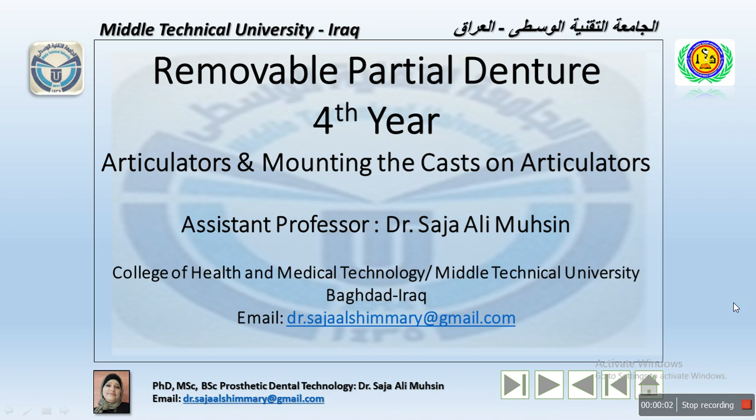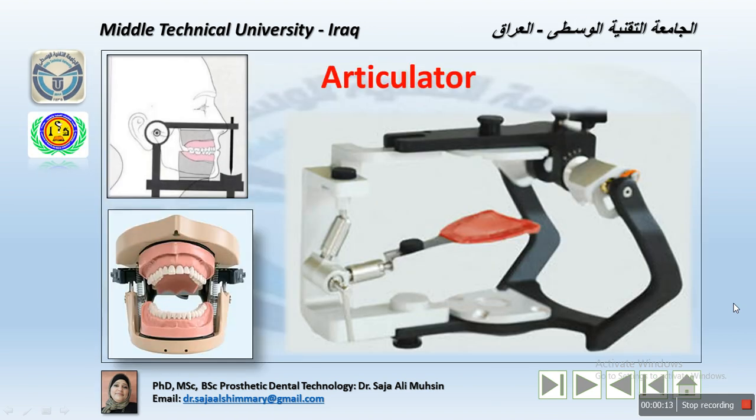Dear students, the lecture for today is the articulators and mounting the cast on articulators. The articulator is defined as a mechanical device which represents the temporomandibular joints and the jaw members to which the maxillary and mandibular casts may be attached to simulate jaw movement.